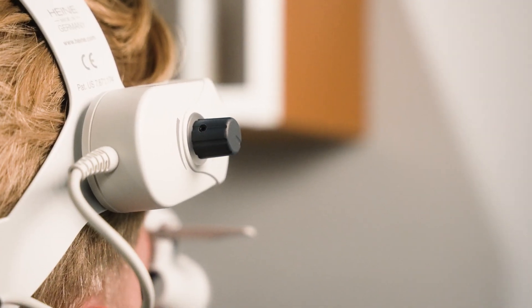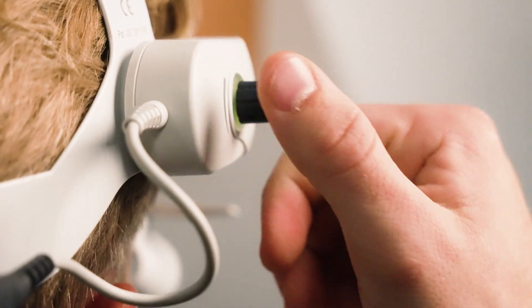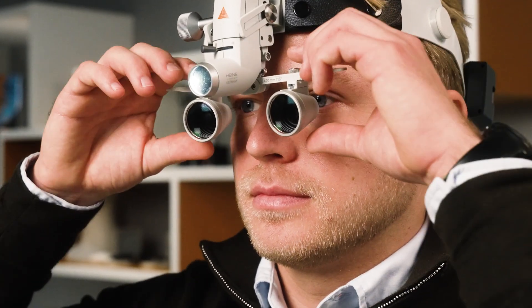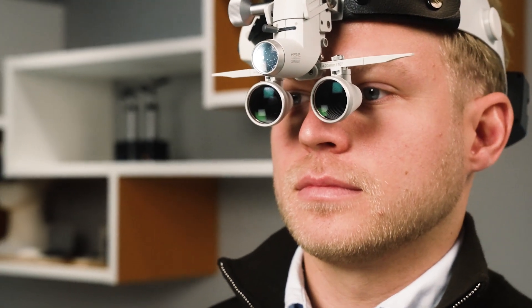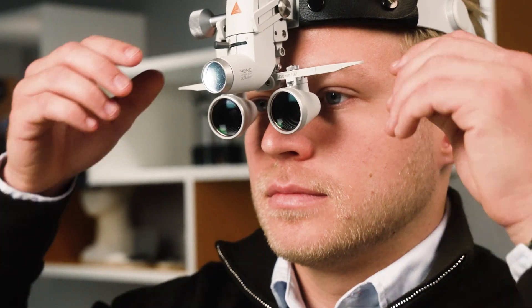Now let's set up the correct illumination for the visual area to ensure that you see sharp details with the loops. Switch on the light at a low level — the knob is on the right side. Slowly move both loops on the rail from the outside inwards until the viewing area through both loops are overlapping completely and only one clear viewing area is visible. To finish, fix the locking screws of the loops.